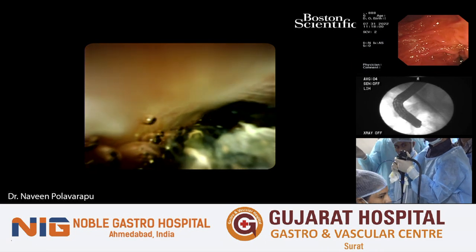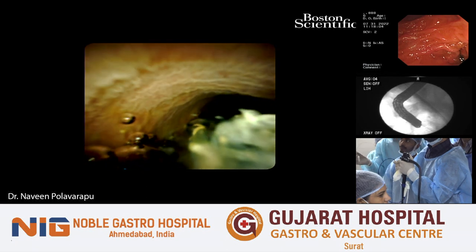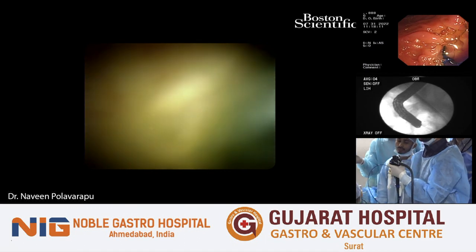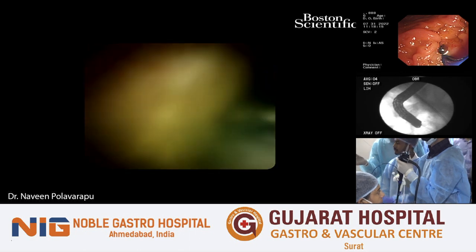Because as I said, the cholangiogram pictures, I was not so confident about. Now you can see I'm actually falling back here. I can see on my duodenoscope that I'm actually falling back. So I'm just pulling back, so try to get into the position. I don't know whether you notice it on the duodenoscope view. I've fallen back a little bit.